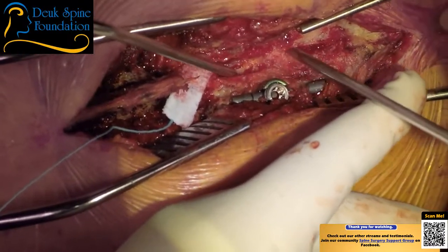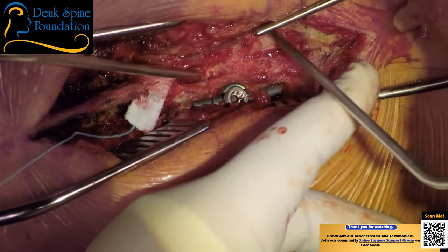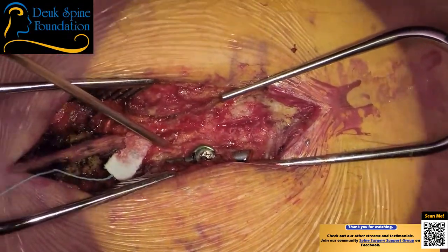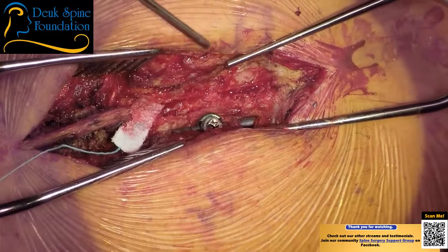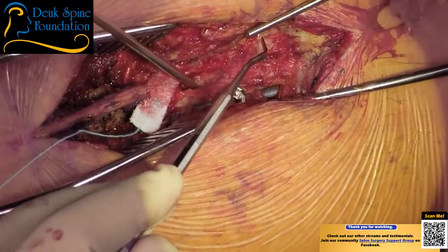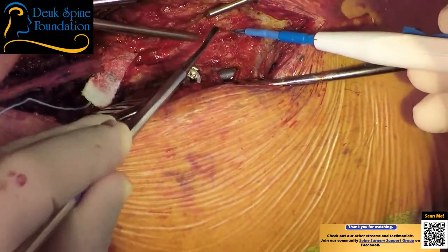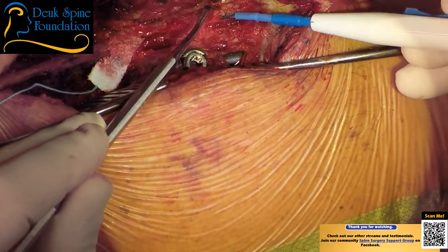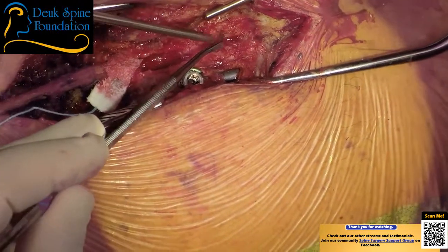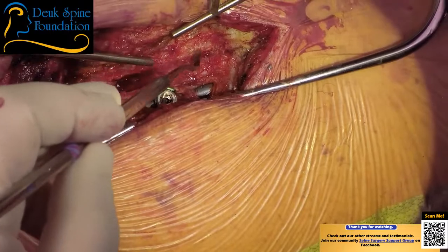I really need to get through here. That's my goal, right here. Question is, what am I dealing with here? Actually, let's have a woody and a bovie. So I've got to figure out what I'm dealing with here. That's scar tissue. But the question is, am I lateral to the lamina? It looks like I am. Let me have a large bite for a second. It's a little bit of scar tissue there.